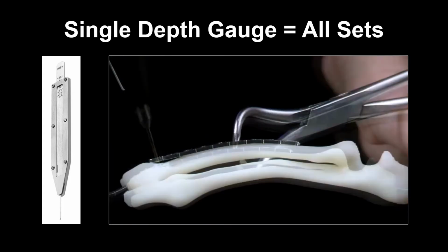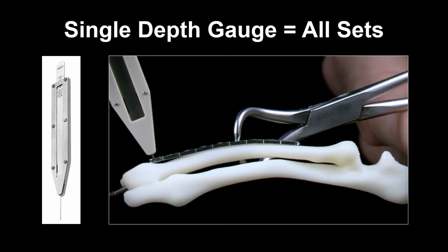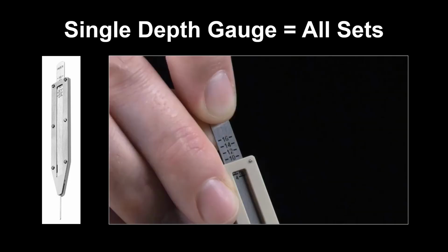Let's look at how that works. Using the depth gauge, measure the hole depth, including plate thickness. The depth gauge is read on the outer end of the gauge body. Remember to add 1/2 to 1 millimeter to the measured screw length to account for the tapered cutting flutes at the screw tip. Here, we would select a 10 millimeter screw.